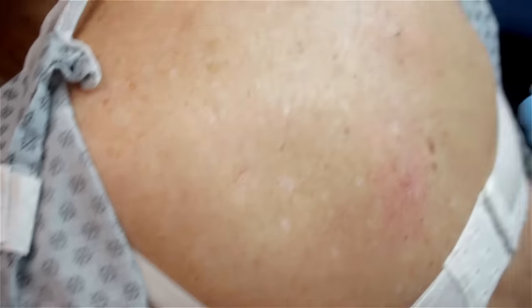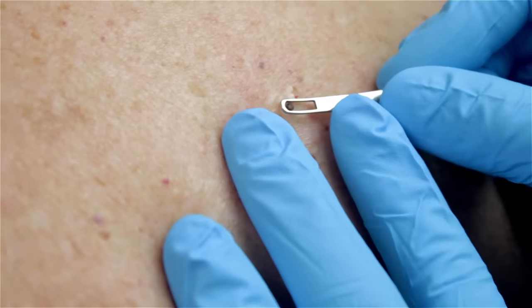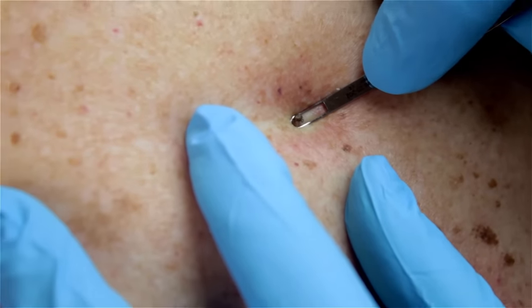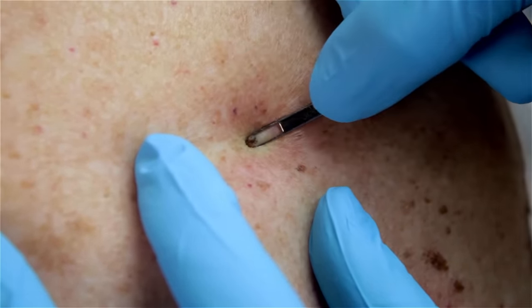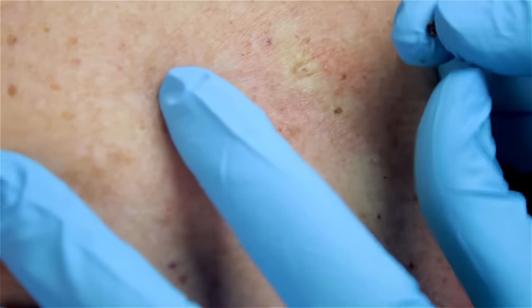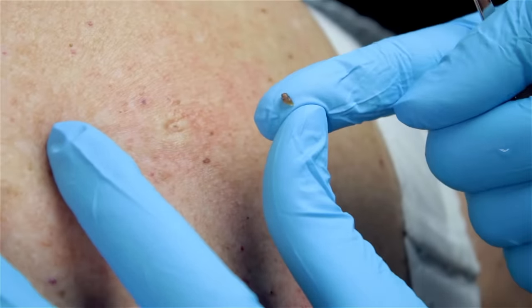And then this one up here probably... You got one out already? The big one, yeah. And then this one really suits itself to the comedone extractor — the size is just really nice for pushing down on the sides with that. There it is. Just a little sebaceous material, keratinous material.